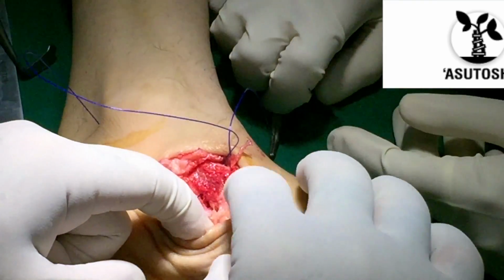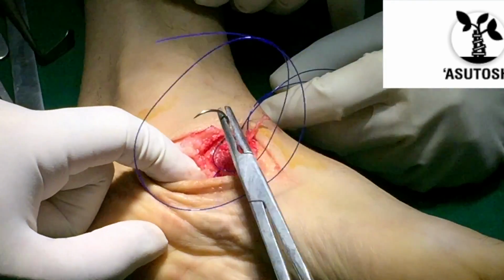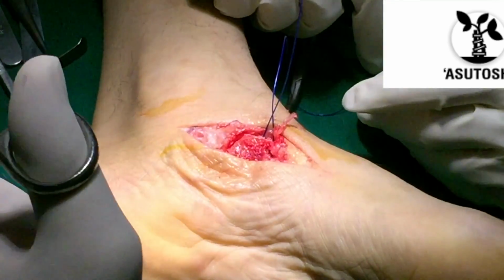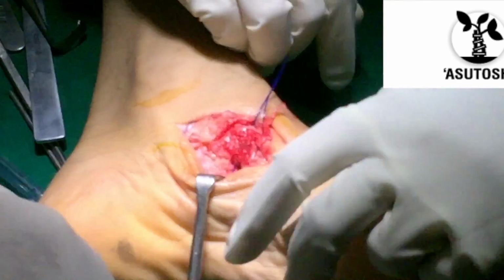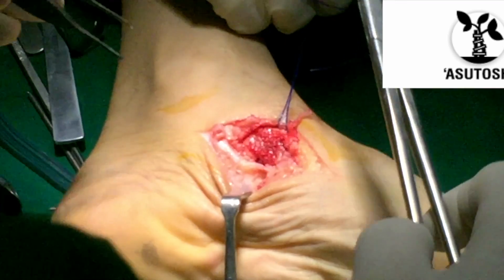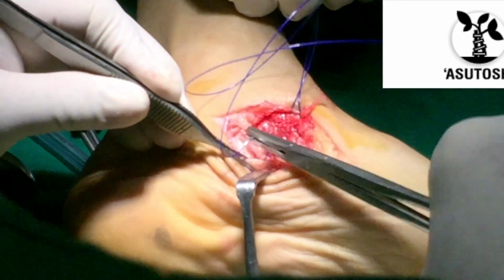During this portion of the time, we have to maintain the arc of the foot as much as possible, placing the foot into an appropriate cavovarus position to restore the arc.